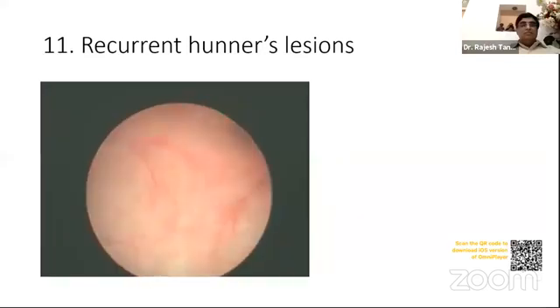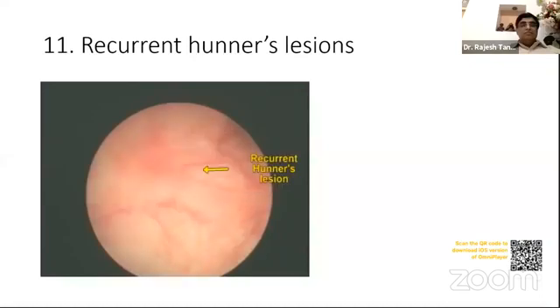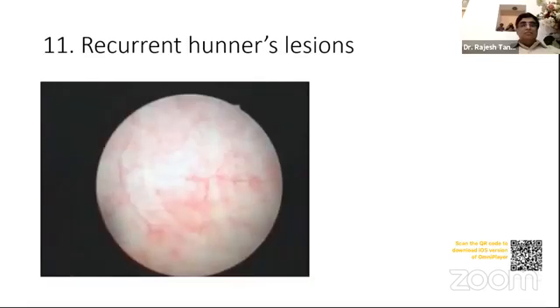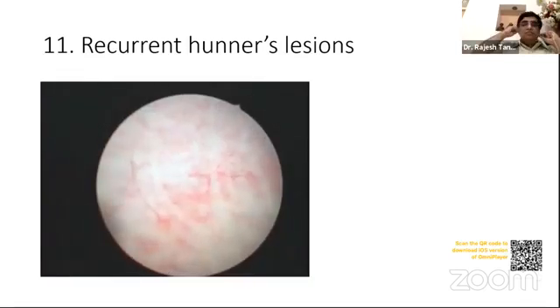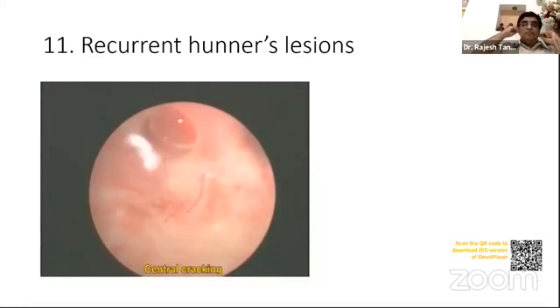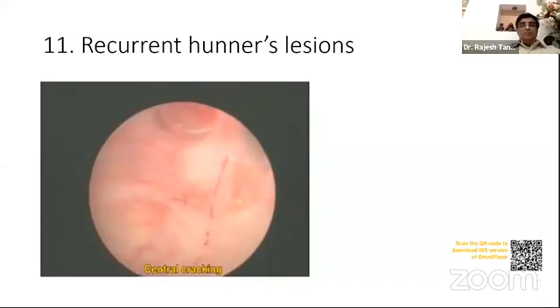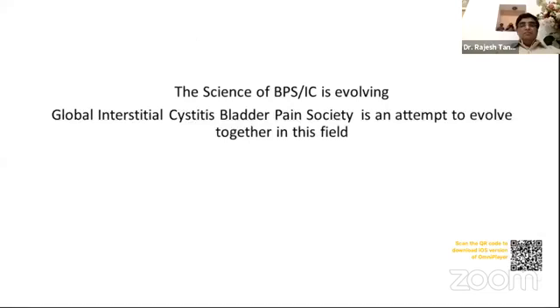The patient had been treated with hydrodistension and fulguration of Hunner's lesions with good response for over two years. This cystoscopy was done for relapse of symptoms. Note the central cracking upon hydrodistension. The science of BPS/IC is evolving. Thank you.